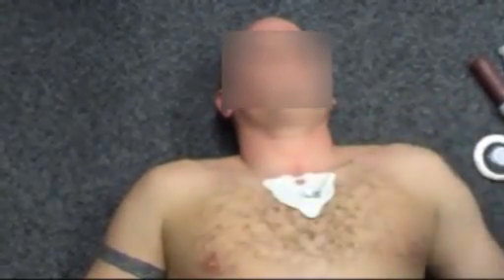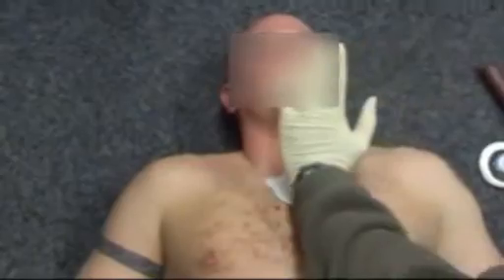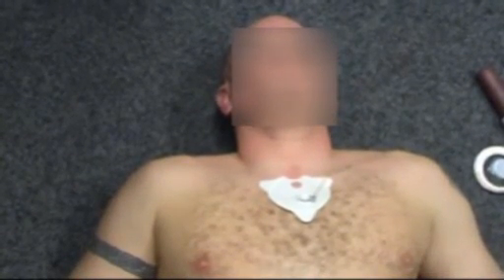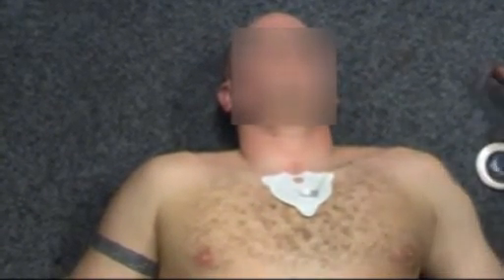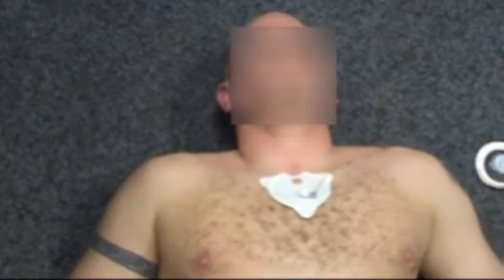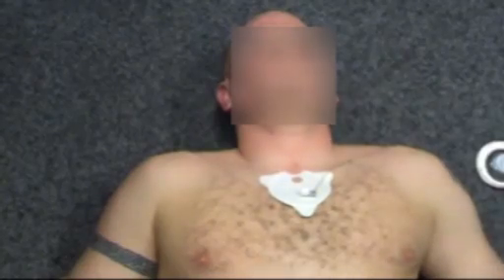Now notice how the angle is up like that. So what you've got to do is, when you put it in, you've got to make sure that it is perpendicular to the skin — that's the most important thing. This comes like this. Open it — that's how they come. I might need to move around because I've got to get in.